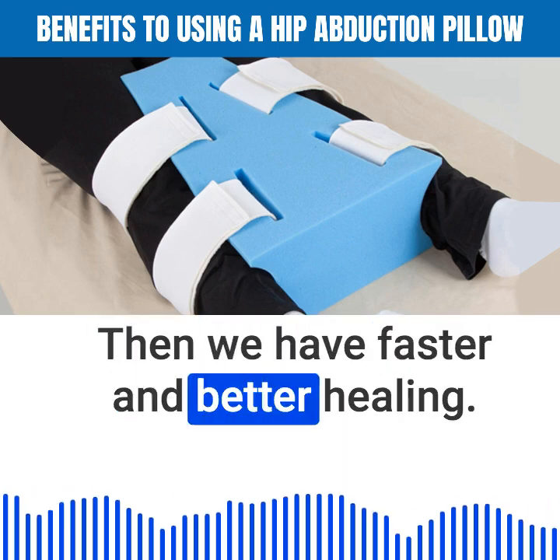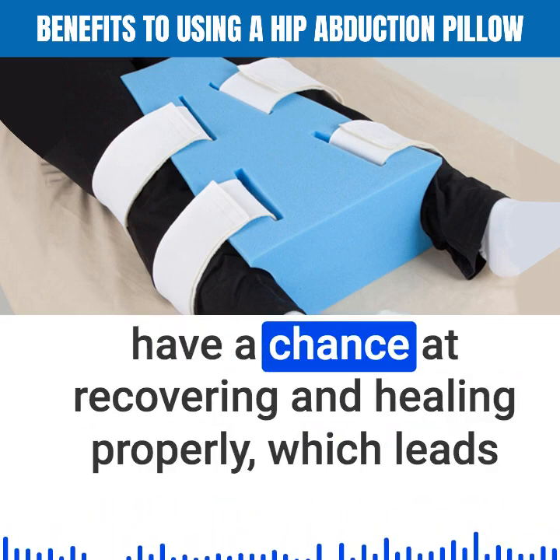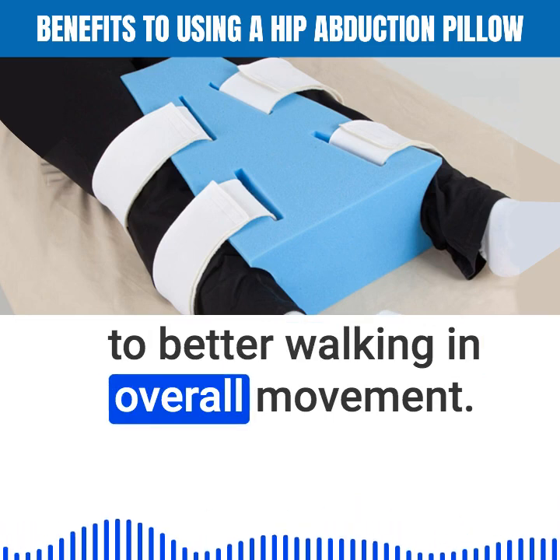Then we have faster and better healing. Keeping the hips neutral with the pillow means that the hips have a chance at recovering and healing properly, which leads to better walking and overall movement.